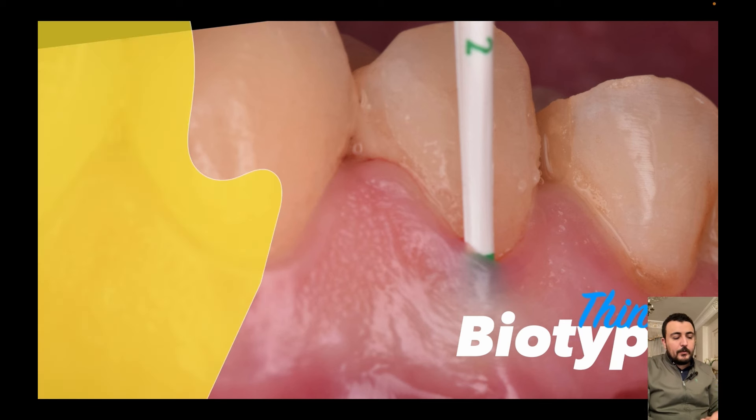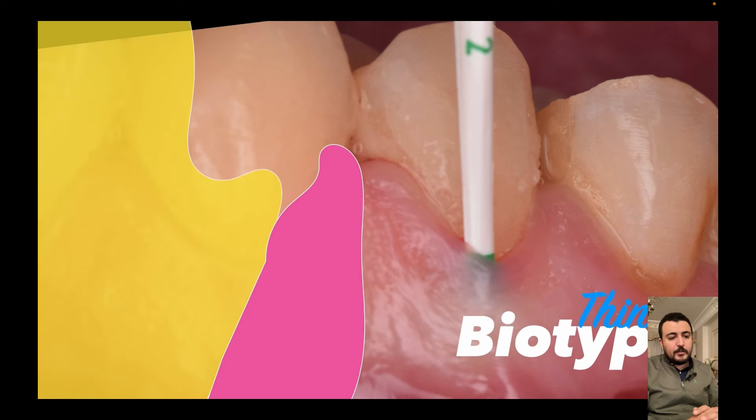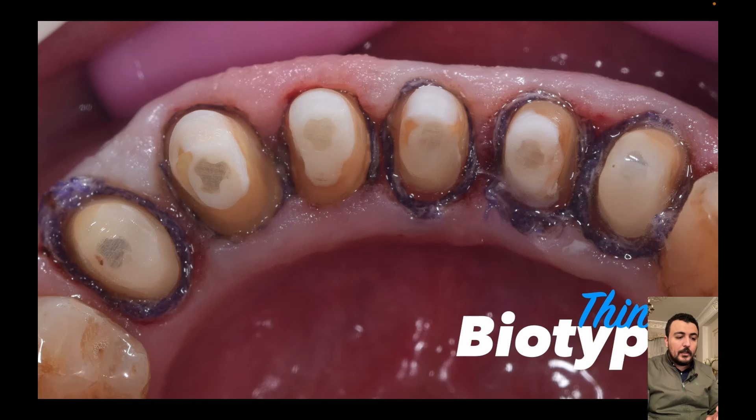Moving to another situation in which we have a very thin biotype gingival tissue. In this situation, placing a single cord might not be enough for achieving good retraction, and the soft tissue might collapse over the margin and over the retraction cord. Using a larger cord or double cord technique might cause heavy pressure and trauma to the soft tissue with subsequent gingival height loss and permanent recession. In the mandibular anterior zone, mandibular pre-molar zone, and also the maxillary canine zone, gingival tissue is very thin, especially from the buccal side.